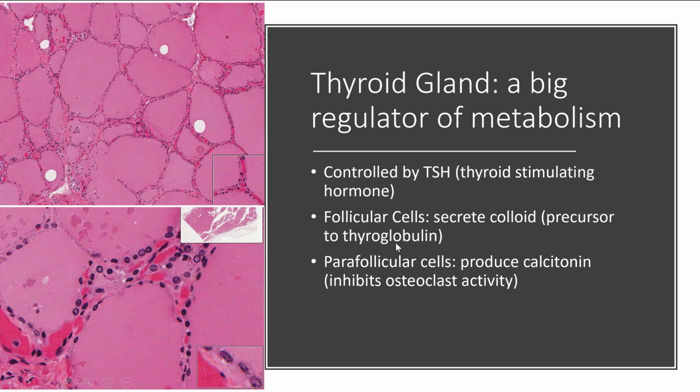Okay. And then you also have these parafollicular cells. So parafollicular means by the follicle, right? Or next to or beside the follicle. So here we've got all our follicular cells, right? Neatly lining the follicle. And you can see how there are these cells in between that. These bubbly cells in between these follicular cells. These are going to be your parafollicular cells, okay?